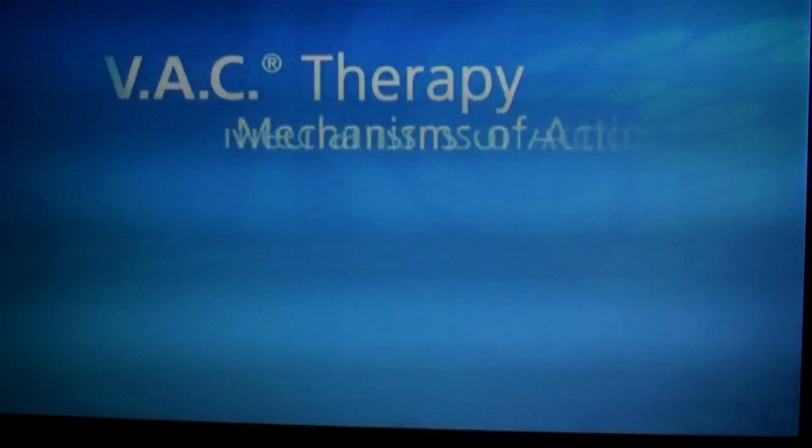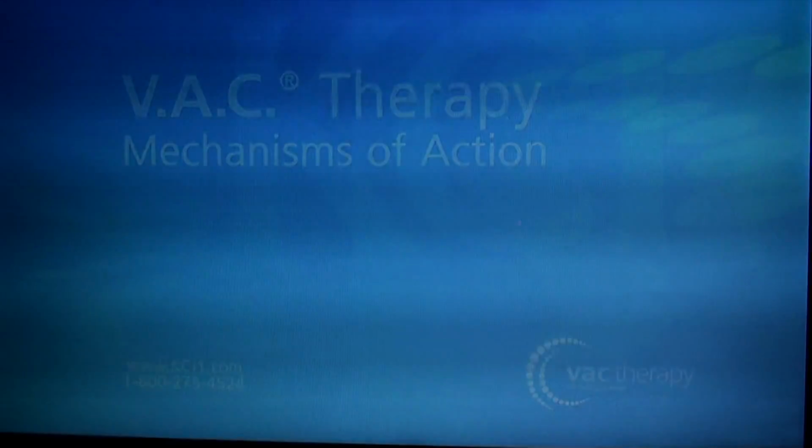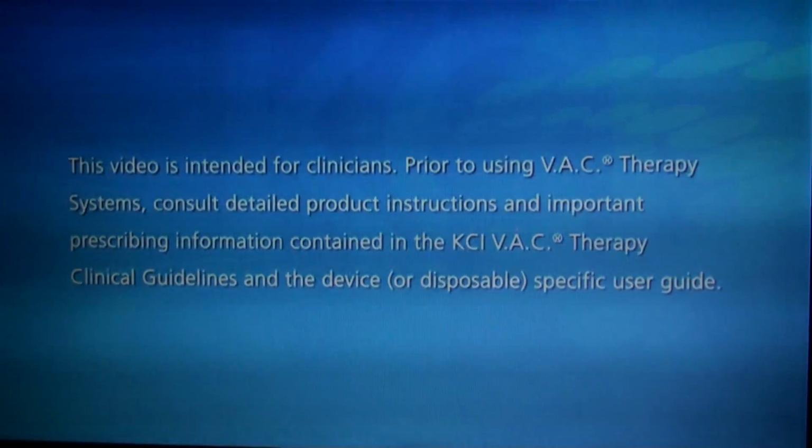VAC therapy, mechanisms of action. This video is intended for clinicians.